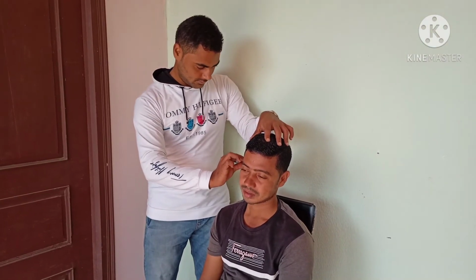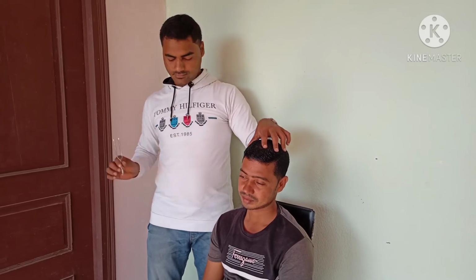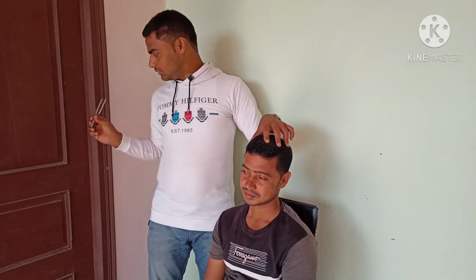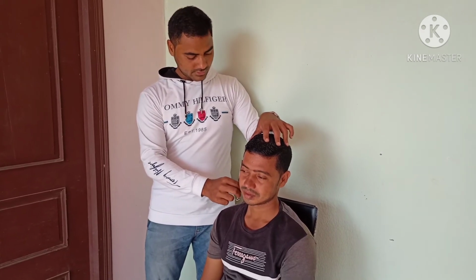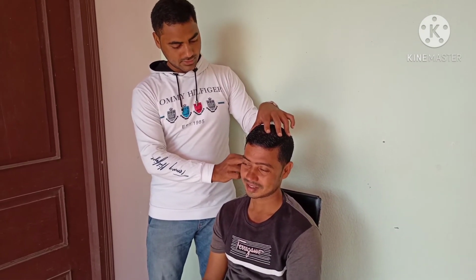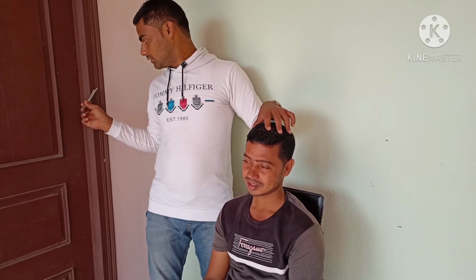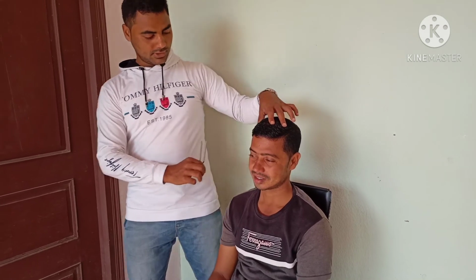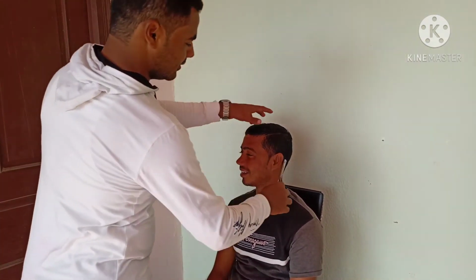Now perform the Rinne test to compare air and bone conduction. Put the vibrating fork on the mastoid bone. If the patient says the sound is no longer heard on the mastoid bone, immediately put the tuning fork at the ear canal.